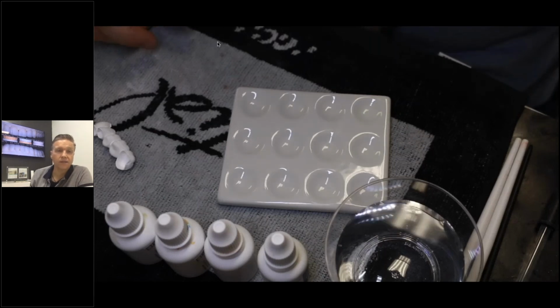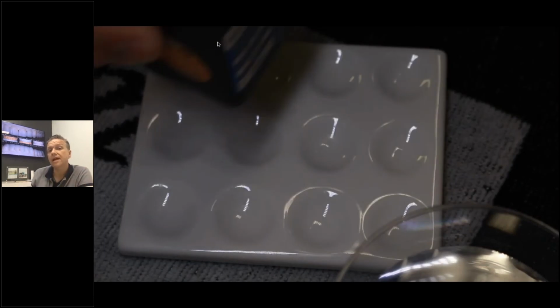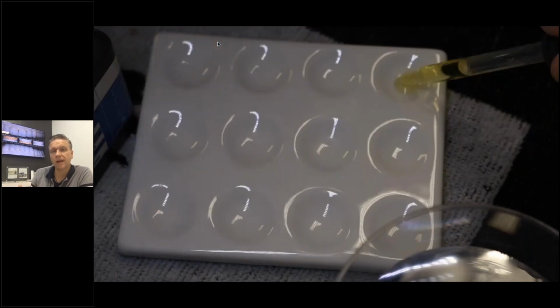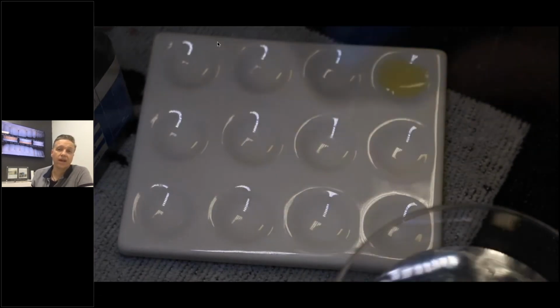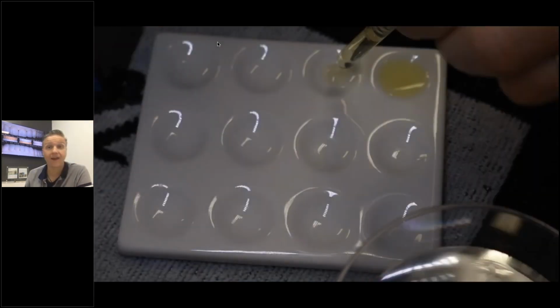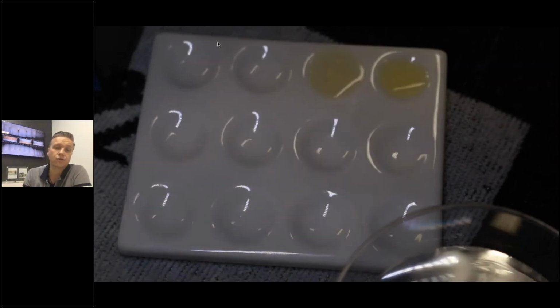I also use the Ceramic Liquid Eye to show what I already colored and where not, where I still have to go over. It keeps me a little bit better control over my coloring. Now you see here, I'm putting some dentin on, and the control factor is very important, especially on bigger restorations. It's very easy to get lost. How many times did I now paint A2 in this area, or on all my 12 teeth? So that definitely keeps me on track and avoids that I'm losing control.